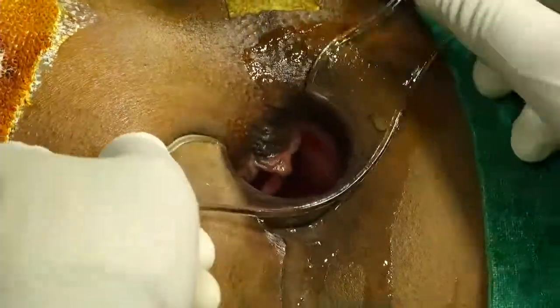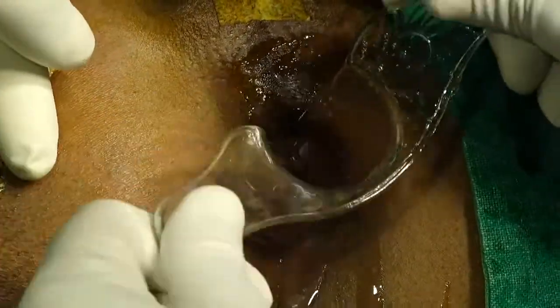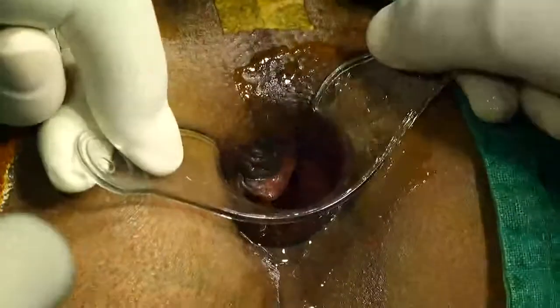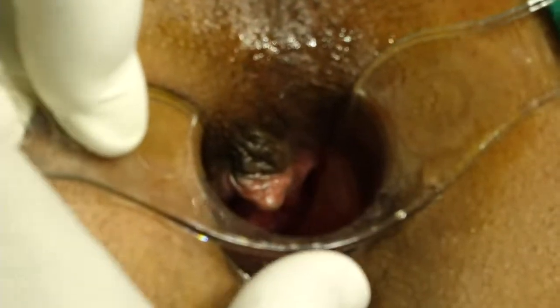Just as far as vascularity is concerned, we will go 1 or 2 centimeters above the dentate line. Yeah, give me. Suture this, using PDS. PDS or Vicryl, it depends on the availability of the material. Yeah, please focus inside, so you can see that. The maximum girth is 5 mm, we will take 5 mm. See that? Can you see the dentate line, sir?